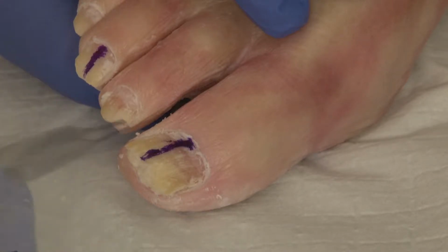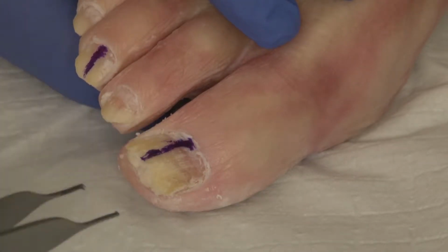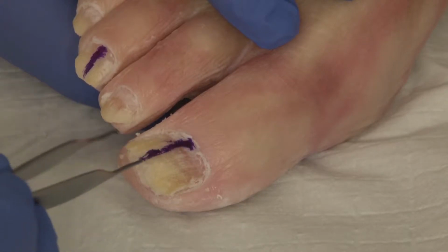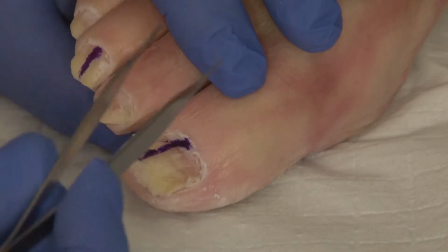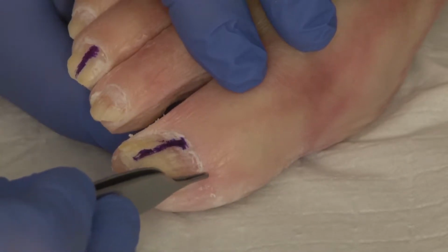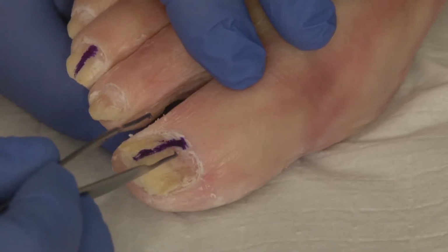With a skin marking pen, we have marked the nail to simulate a lesion of longitudinal melanonychia. These lesions are derived from the nail matrix, and they impart melanin into the nail plate. The diagnostic portion of the biopsy, therefore, must be in the nail matrix. What we are going to do is incise on the cul-de-sac of both the medial and lateral aspects of the toe and elevate the proximal nail fold to expose the lesion.